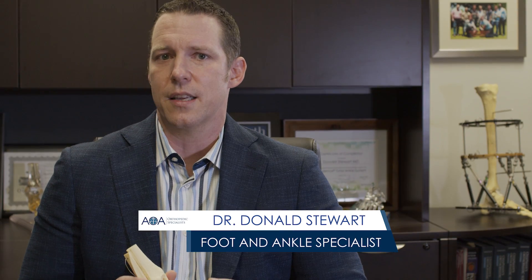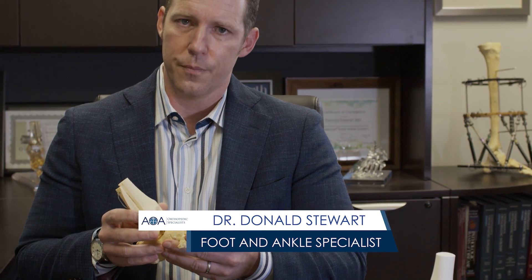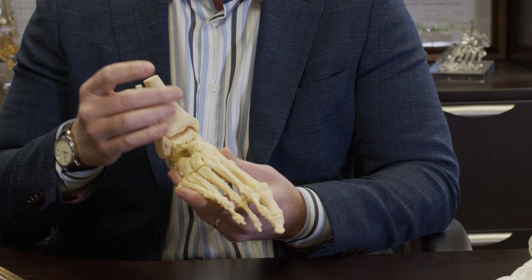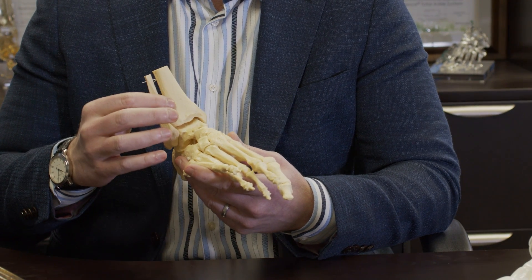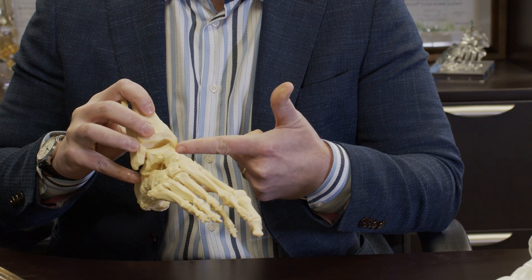We're going to talk about how we do an ankle replacement and what exactly an ankle replacement is. This is a model of the ankle, and it's important to understand some basic anatomy. We have the shin bone here, the little bone called the fibula, and then this ankle bone right here is called the talus.